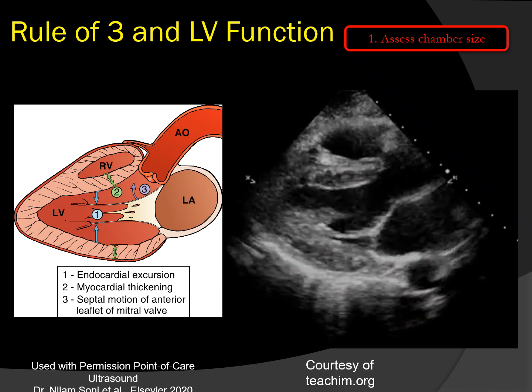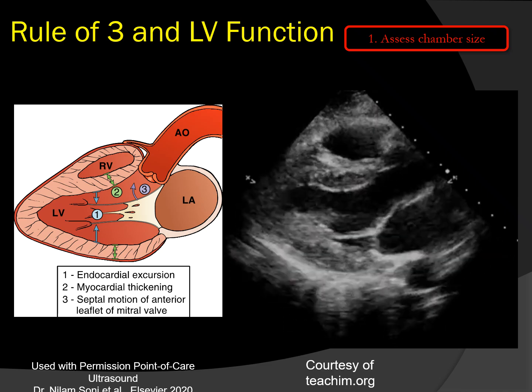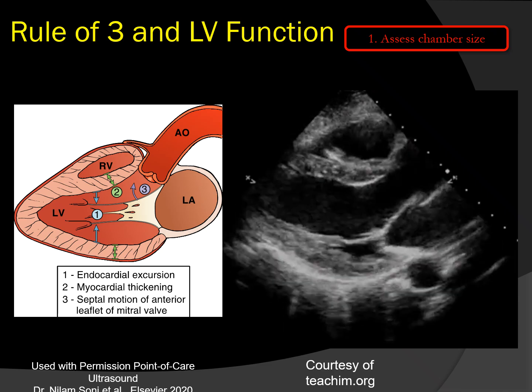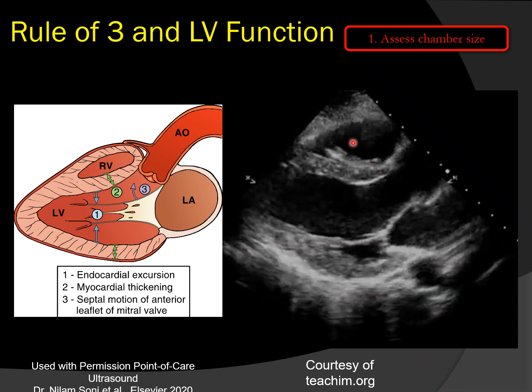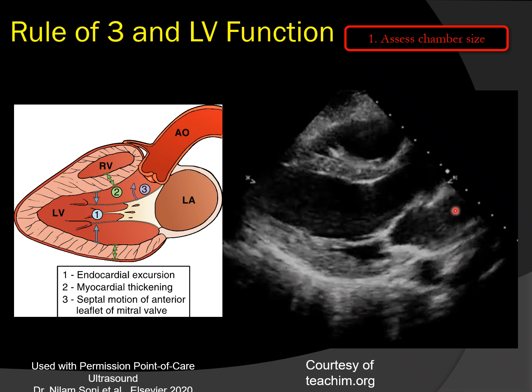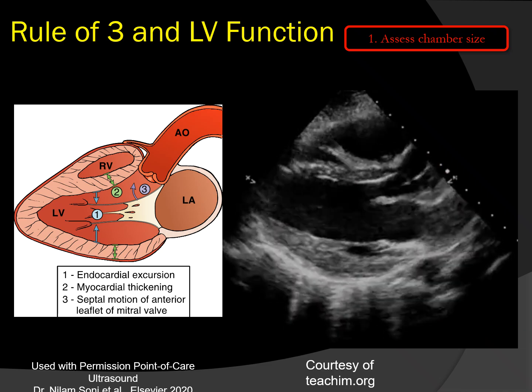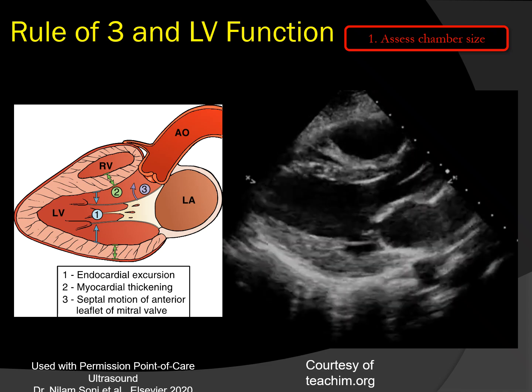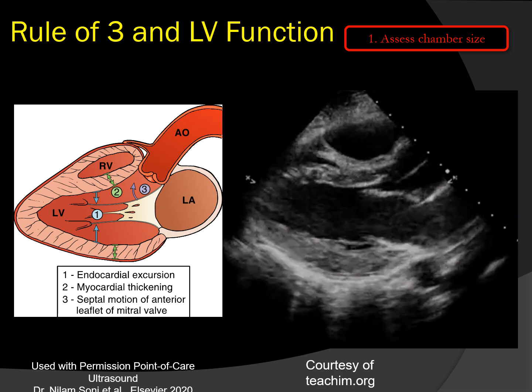problem. For example, if a patient comes into the emergency room acutely short of breath, and we do a parasternal long axis of the heart and determine that the right ventricular outflow is much larger than the aorta and the left atrium, I'm going to point my attention towards that end. Something on the right side of the heart may be causing the patient's symptoms.